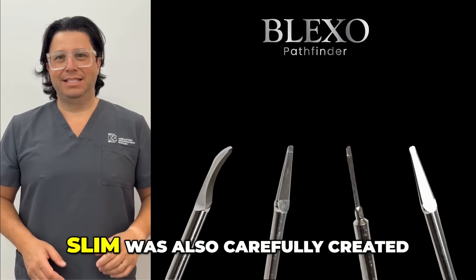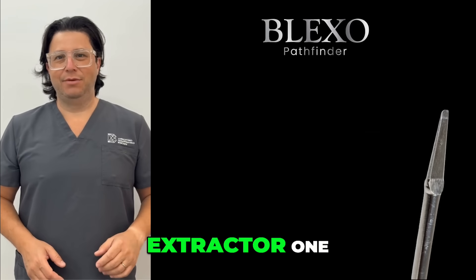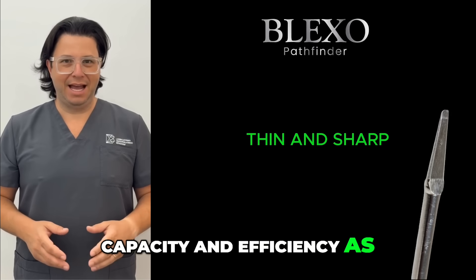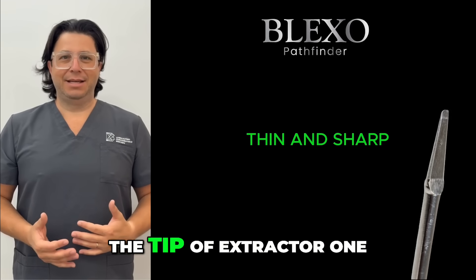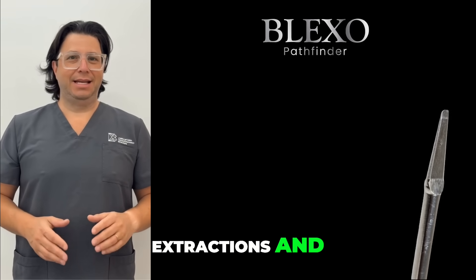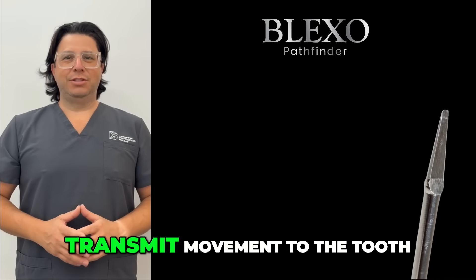That's precisely why the Slim was also carefully created, serving as another essential instrument in the BLEXO product line, which closely follows the general shape of extractor one but is considerably thinner and noticeably sharper. So it offers a superior capacity and efficiency as a periodotomy instrument compared to the tip of extractor one. The same goes for extractor two, which is commonly used in most extractions and allows you to start levering the tooth — it has a periodotomy effect but also the ability to be rotated to transmit movement to the tooth.